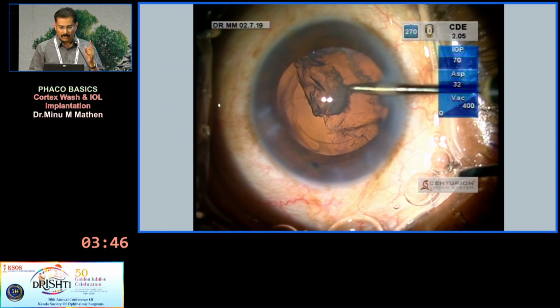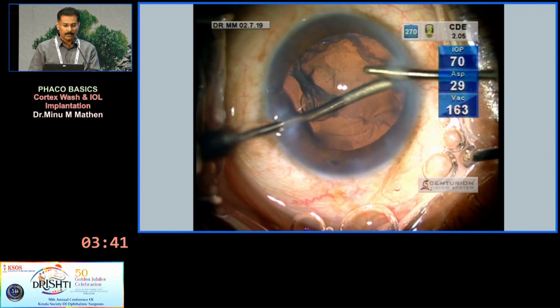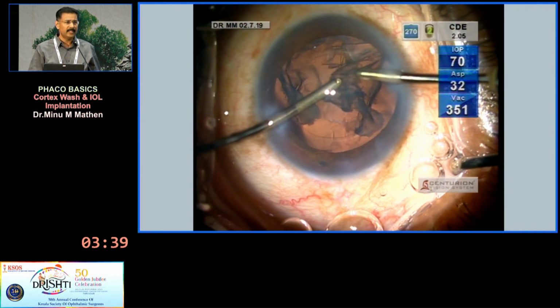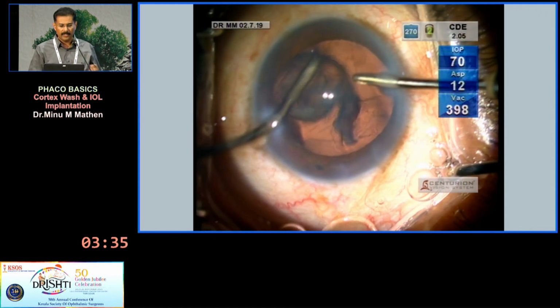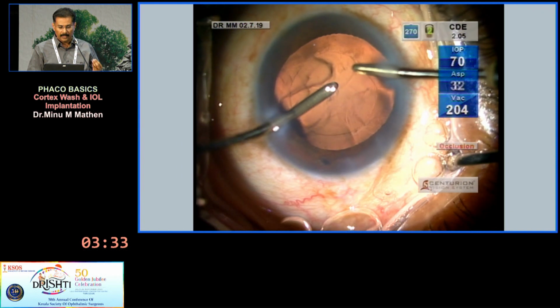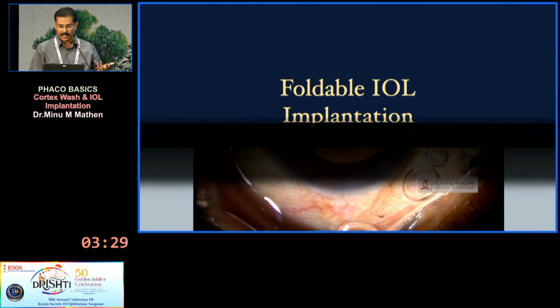Last 1 minute. So exchange hands; you need 2 paracentesis here to aspirate the 180 degrees. The advantage is that you can reach all clock hours very easily. Very good, but you need 2 paracentesis. You need to adjust to the lower irrigation which you have.